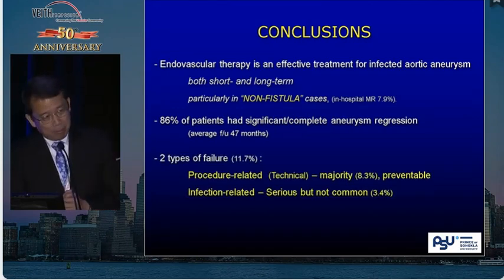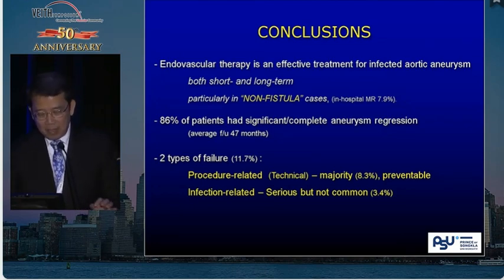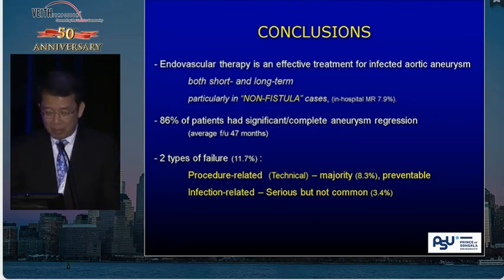There were 2 types of failure. And we believe that the most common failure is related to the procedure, the technical, that we did not cover far enough. We believe that it may be preventable. Infection-related recurrence did occur, serious, but not that common.